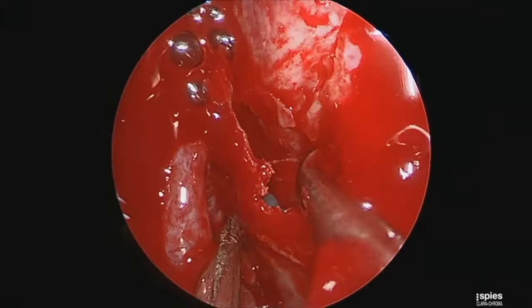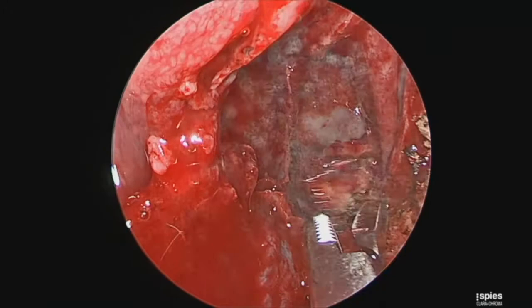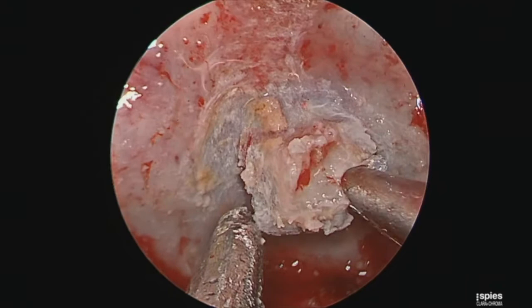Subperiosteal dissection is performed after the inferior and superior cuts are connected anteriorly, and then we dissect back to the sphenoid rostrum. Once the rostrum is identified, it can be removed with a Kerrison rongeur, creating wide exposure to the sphenoid. The contralateral pedicle is sacrificed with suction cautery, and then the remainder of the exposure is performed. Here you can see the very sharp nasal septal spur being dissected from the contralateral side. The right-sided flap is chosen partly because of this spur.